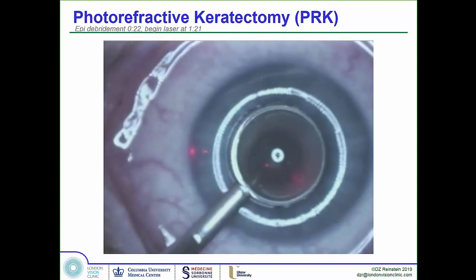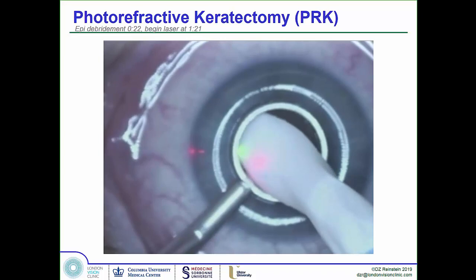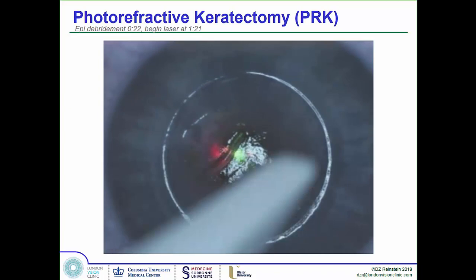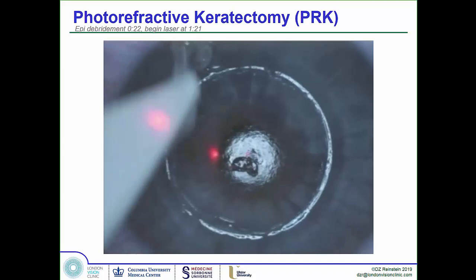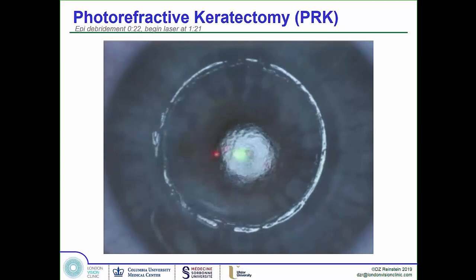When we do PRK, we have a whole protocol for controlling pain. Here's the procedure on video: there's the well, and we soak up the alcohol. See how loose that epithelium is already? Then we very gently wipe the epithelium off with a sponge because all the hemidesmosomes have been broken. Look how specular that surface is — that's Bowman's, a very smooth specular surface. Here I'm using a blunt spatula to open up a small area that isn't quite separated.